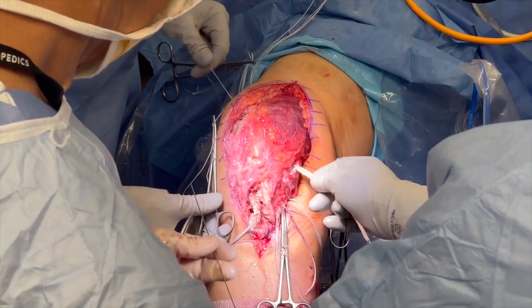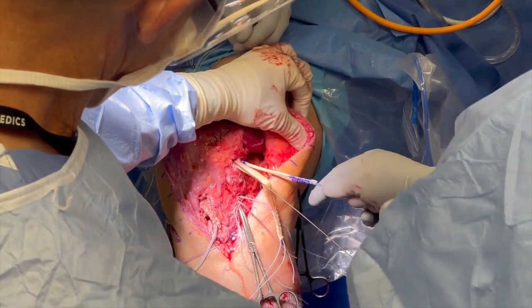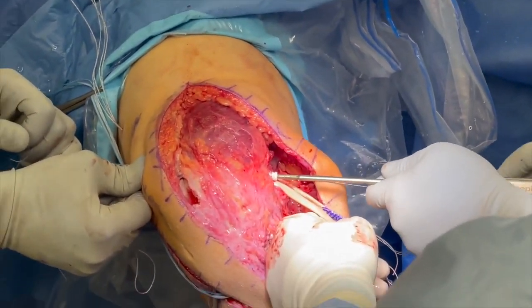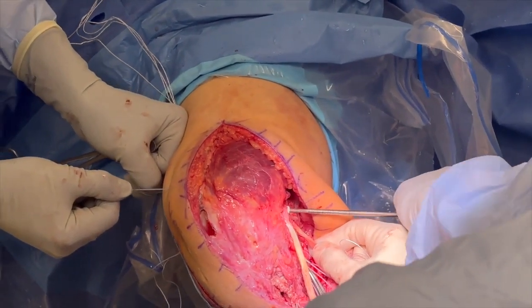The MCL and POL grafts are then passed in their respective femoral tunnels and fixated with 7 by 20 mm bioabsorbable screws. It is important to pass both grafts into their femoral tunnels prior to fixation of either one, because the proximity of the tunnels may result in the initial interference screw impinging on the second graft tunnel, which would interfere with graft passage.